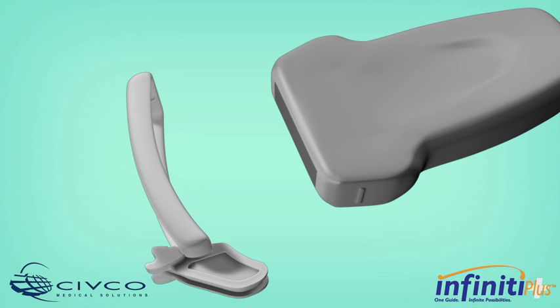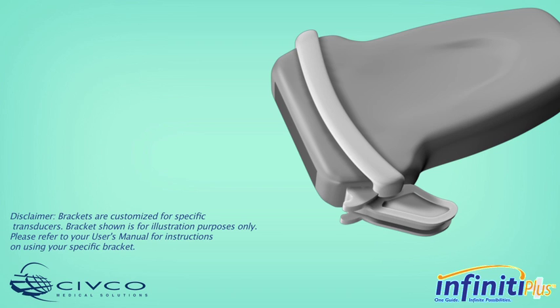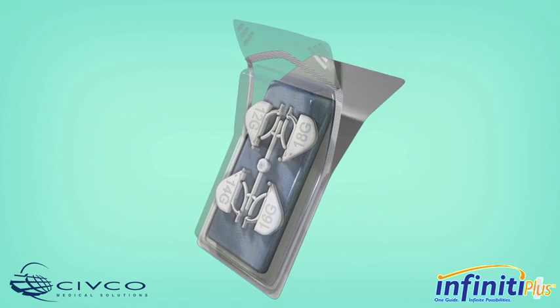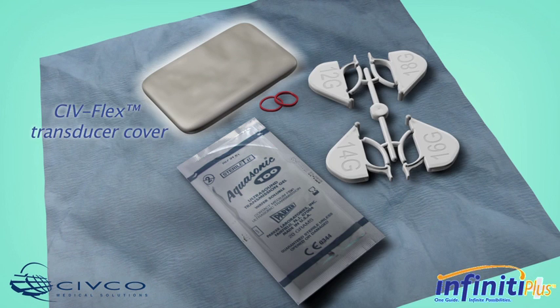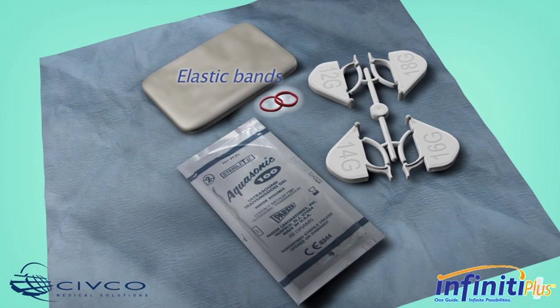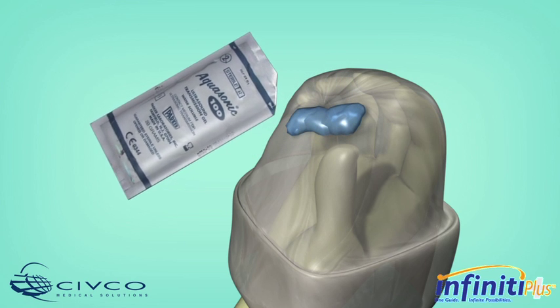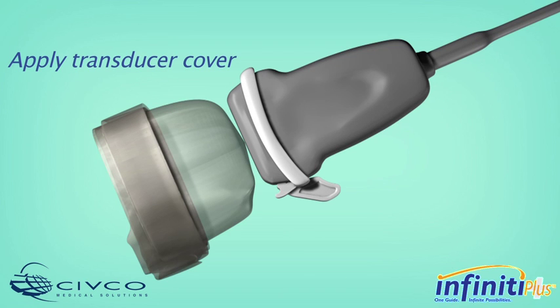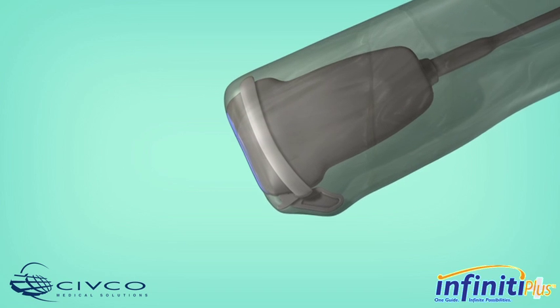Before opening the sterile procedure kit, place the reusable non-sterile bracket onto the transducer. The bracket should snap securely into place according to the corresponding locating features on the transducer. Using proper sterile technique, open the Infinity Plus Needle Guide Procedure Kit. Inside each kit, you will find an Infinity Plus Needle Guide, a protective SIVFLEX transducer cover, gel packet, and colored elastic bands. Open the sterile gel packet and apply gel to the inside of the SIVFLEX transducer cover or directly onto the array of the transducer. Place the gelled SIVFLEX cover over the array of the transducer and extend the cover down over the length of the cord, ensuring sterile technique.